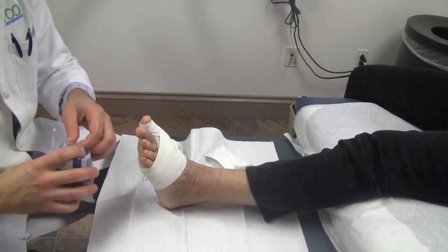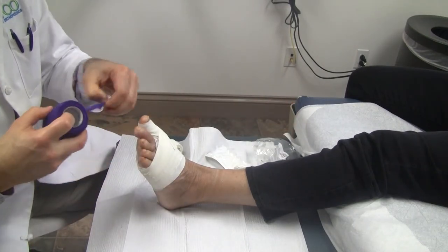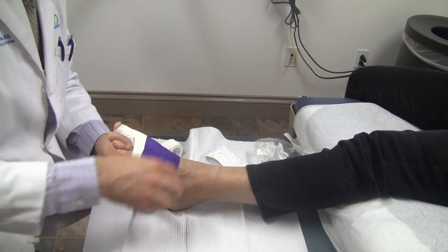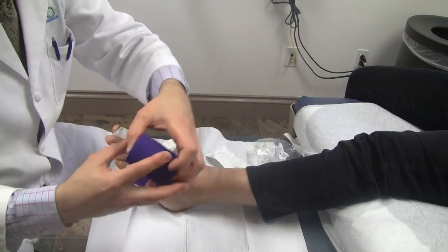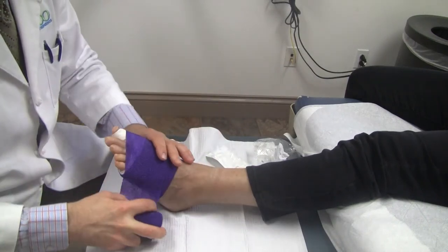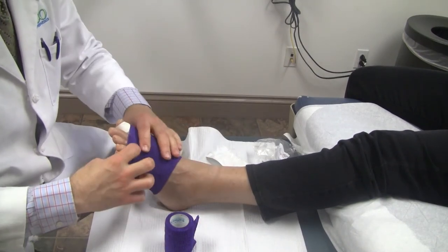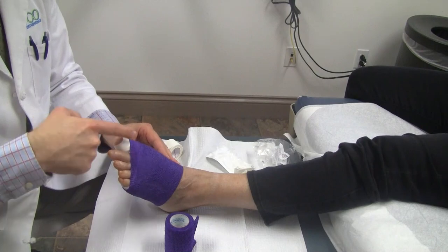Lastly, once all the tape is done, we utilize an adhesive bandage that over-wraps the tape. It makes it look prettier, it keeps it cleaner, and it applies a little bit of compression to keep the swelling down. Wrap around the foot — stretch it out, let it spring back, and then apply it. If you wrap it too tightly, you'll quickly notice a lack of blood supply to the toes. A couple of wraps is all you need. Firmly tear it and it sticks to itself. And there you have a forefoot dressing with tape and gauze for a big toe fusion.